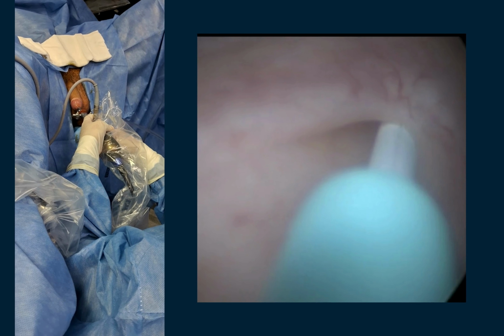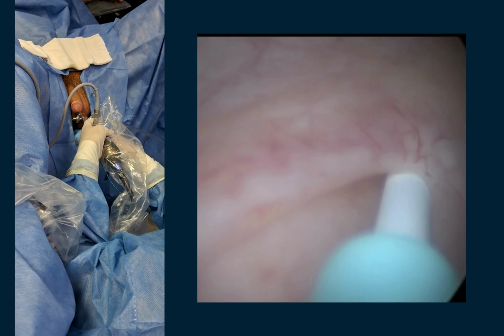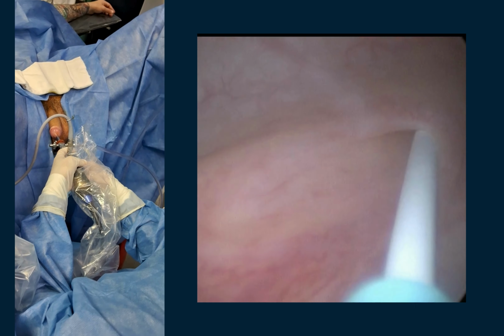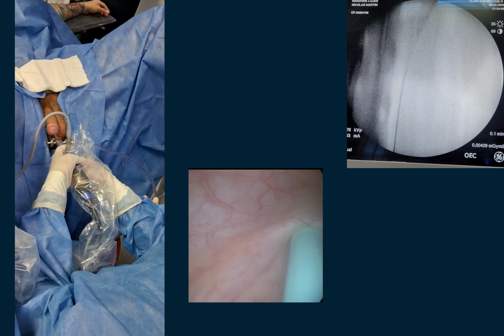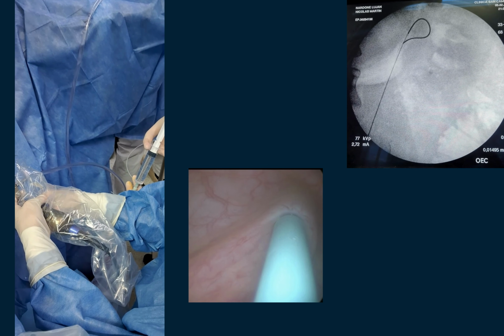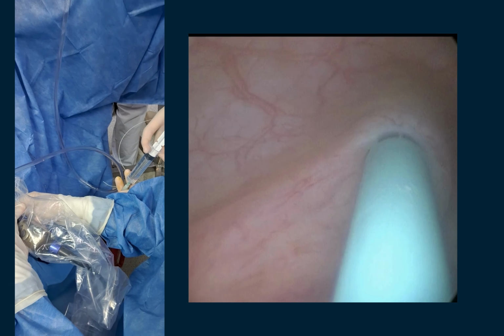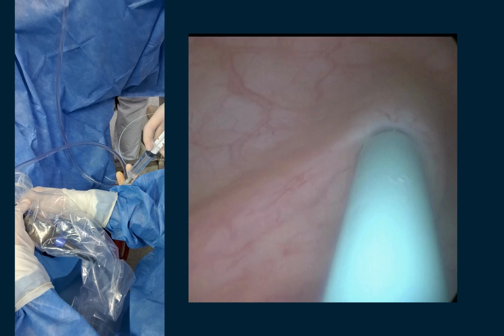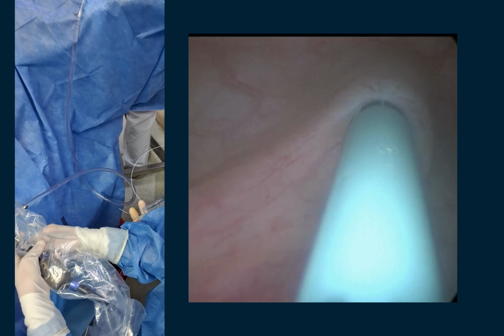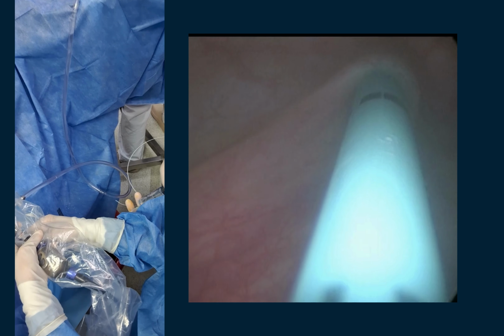Once the cystoscope is inserted into the bladder, the guide wire can be advanced through the open-ended ureteral catheter into the ureteral orifice. It should be advanced until the floppy tip coils in the renal pelvis, as determined fluoroscopically. Advance the open-ended catheter slowly over the guide wire as the wire advances. Be careful when advancing an open-ended catheter up the ureter.